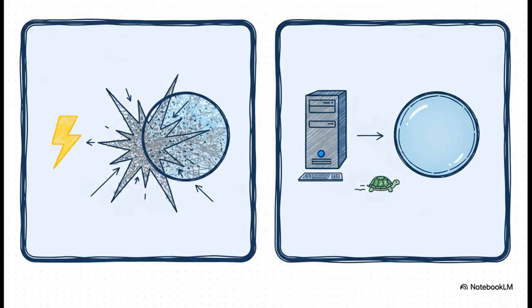Now listen up, because this is a massive, high-yield exam point. You absolutely have to know the difference between the older method, filtered back projection, or FBP, and the modern method, iterative reconstruction. FBP is super fast, it uses barely any computer power. But the downside, it gives you way more image noise and those really annoying star artifacts. IR, on the other hand, gives you beautifully clear images with less noise and far fewer artifacts. The catch is that IR needs serious computing muscle.